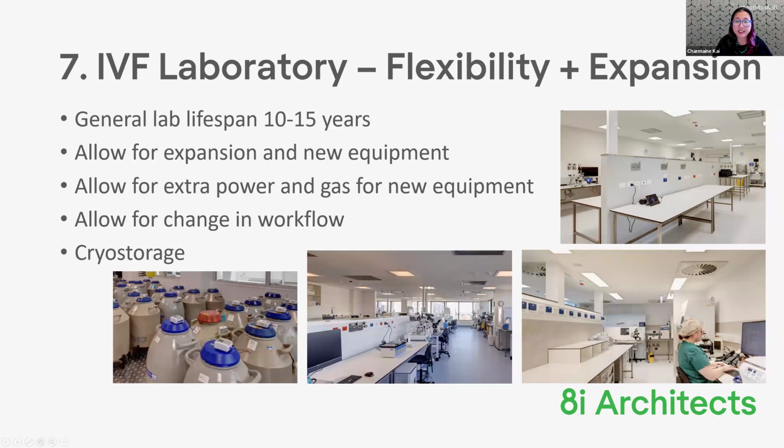Which leads us on to flexibility and expansion. So the general lifespan of an IVF lab is 10 to 15 years before it becomes a bit too tired and probably obsolete, in terms of technology having moved on. I'm sure you've all worked in labs that have had a lifespan of much longer than 10 to 15 years. But if you're looking at building a new lab or expanding a new lab, generally you'll be looking at a 10 to 15 year lifespan.